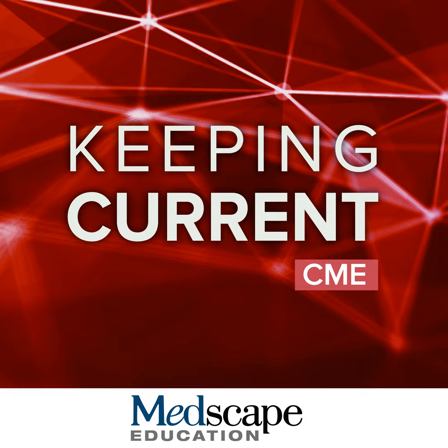Visually, you can see it's a positive scan, and it has a centiloid value of 73.4, so a positive scan. They then came on therapy here at Washington University, and this is the follow-up scan that we acquired clinically. And this is where it's so important.